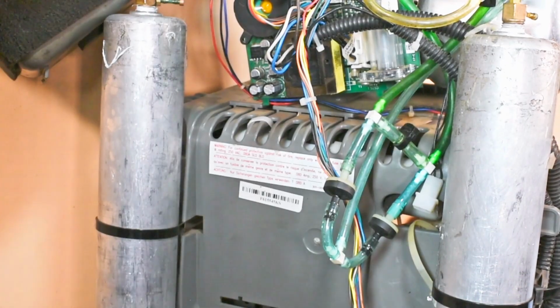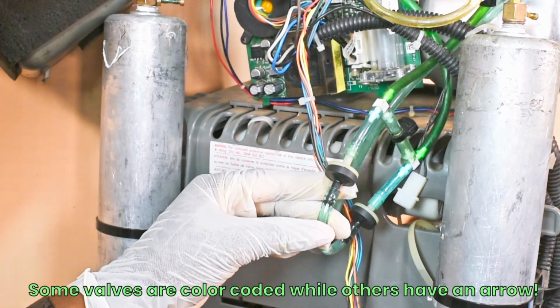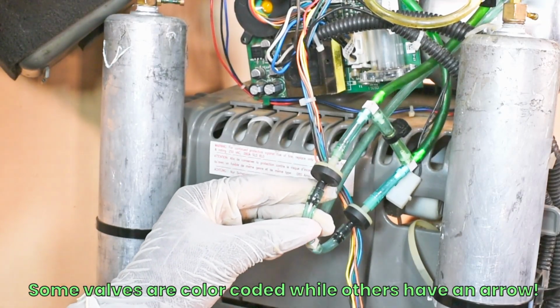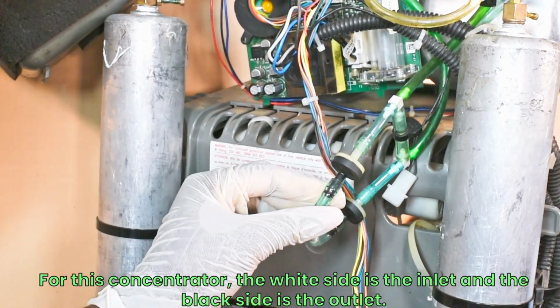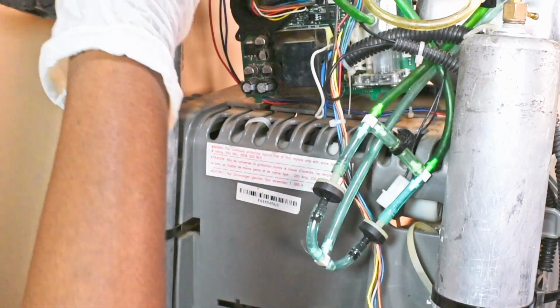To demonstrate the effect of the check valve placement on oxygen purity, I will reverse the direction of this check valve. But before I do that, I would like to verify the oxygen purity of this concentrator when the check valve is positioned in the right direction. I will turn on the machine to measure the oxygen concentration of this oxygen concentrator.